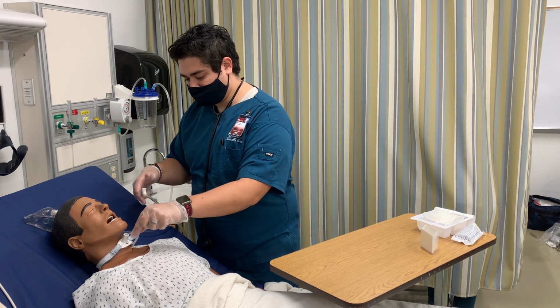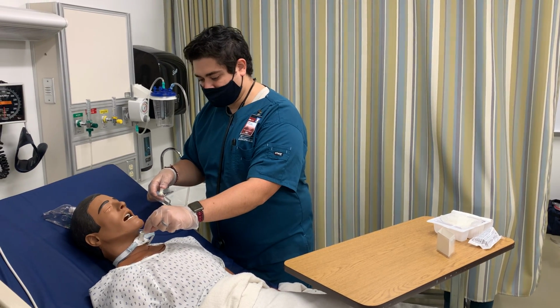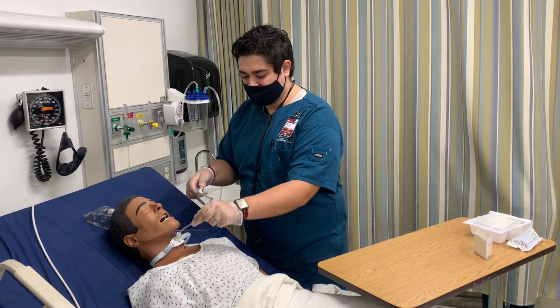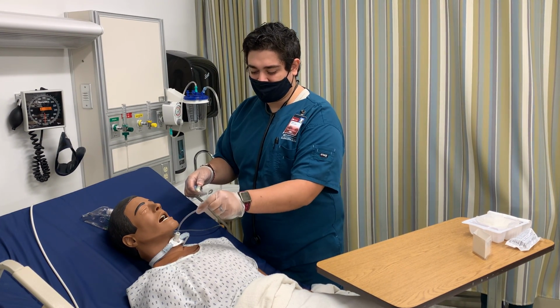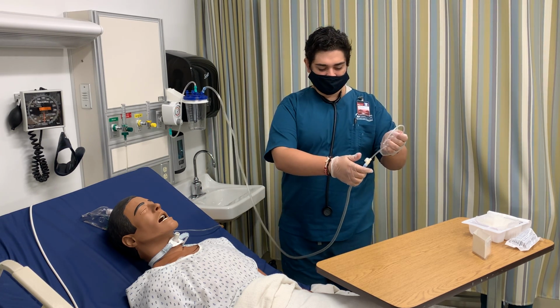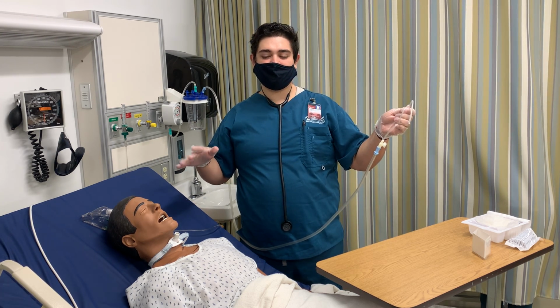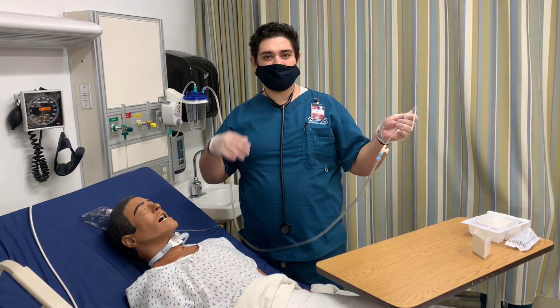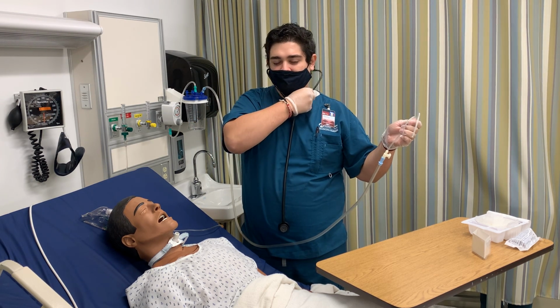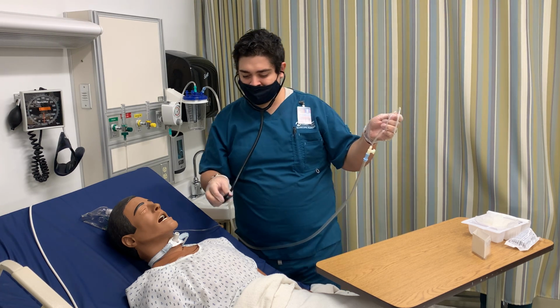Okay. Now that I've reached my point here, I will start suctioning, moving around the suction, making sure I get all sides. Going for at least 10 seconds, but no more than 15. Okay. I am keeping this sterile. I will be doing a full assessment of his respiratory again, just to see if there is a need for resuctioning. This is my non-sterile hand, so I will be using that to listen here.